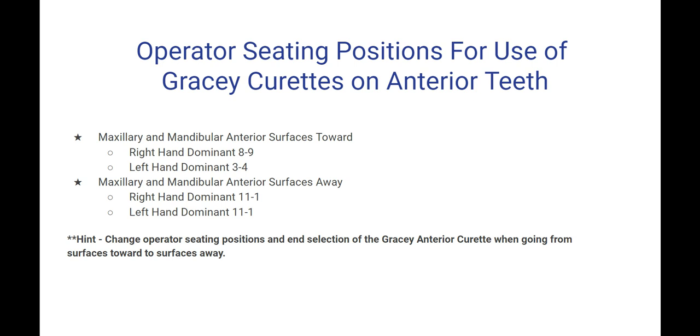A hint: change operators' seating positions and end selection of the Gracey anterior curette when going from surfaces toward to away.